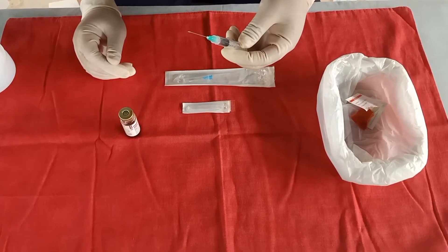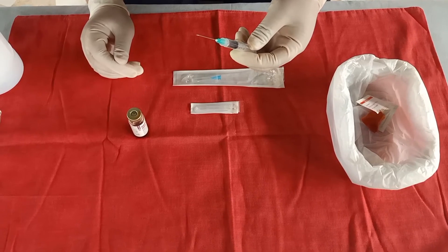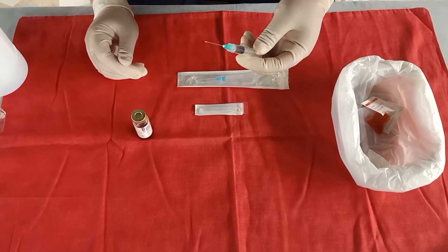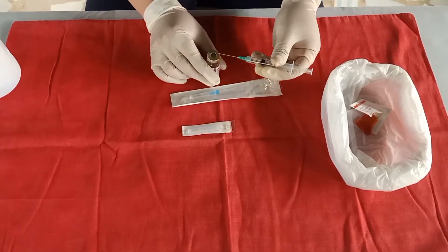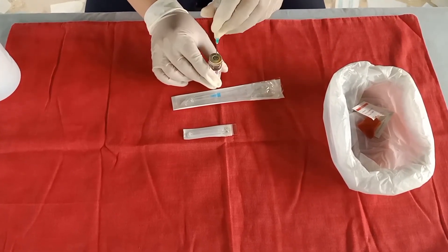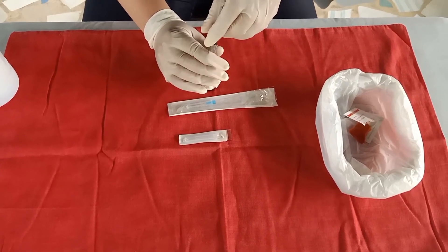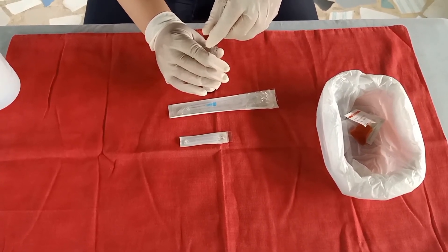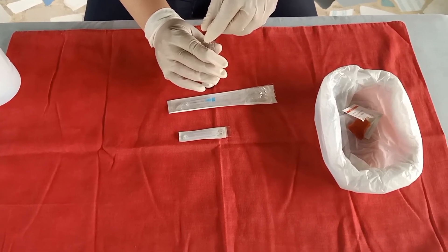Carefully insert the needle into the upright medication vial through the center of the rubber cap, maintaining the sterility of the needle. Inject the air into the medication vial, keeping the bevel of the needle above the surface of the solution.